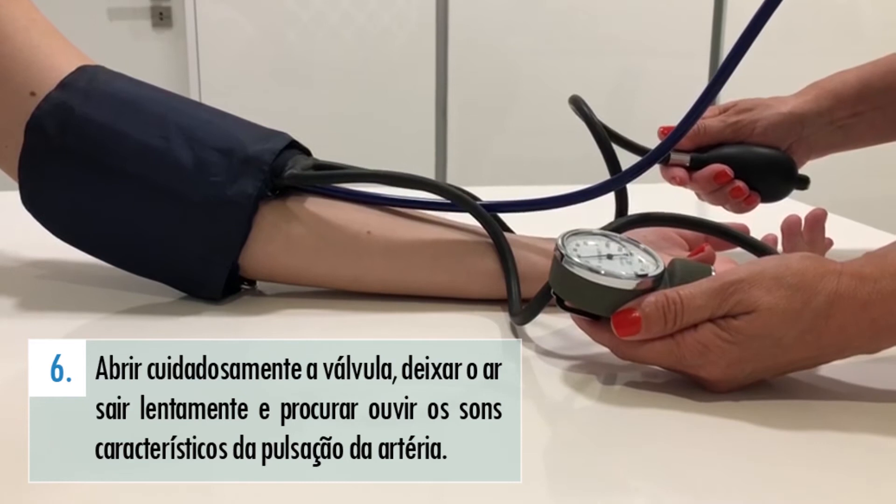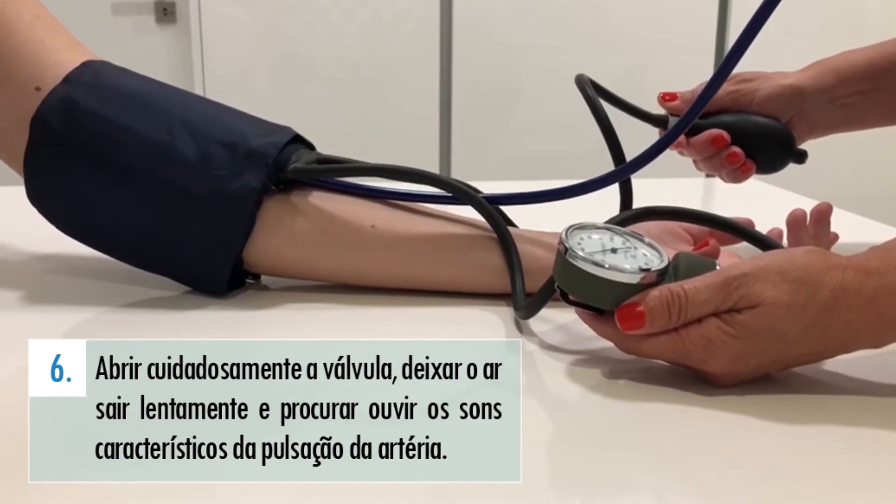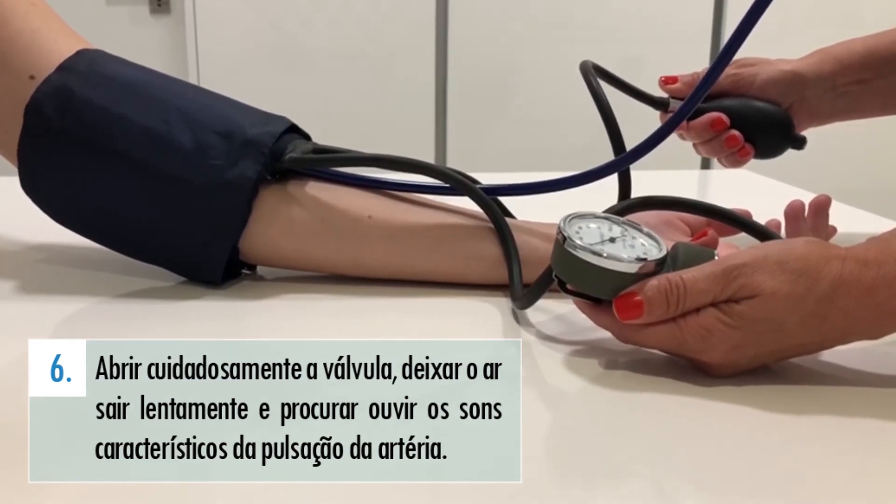Abrir cuidadosamente a válvula da bomba, deixar o ar sair lentamente e procurar ouvir os sons característicos da pulsação da artéria.